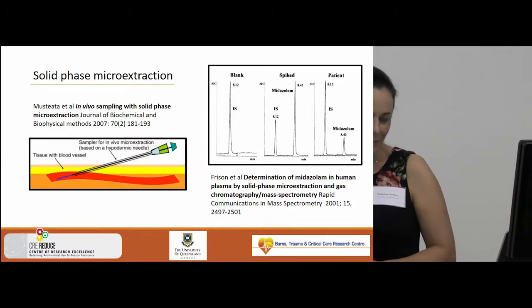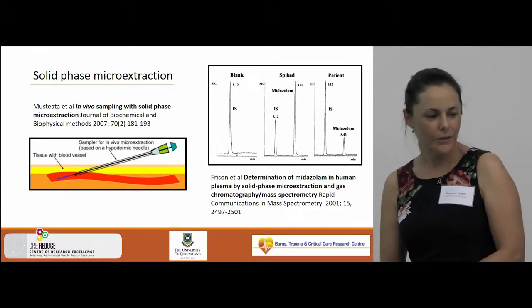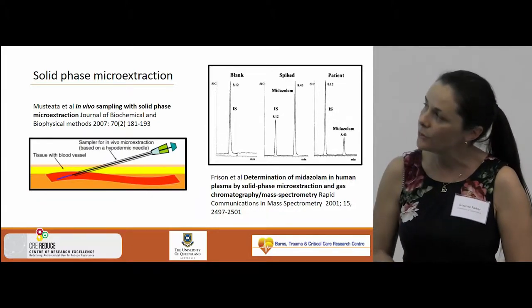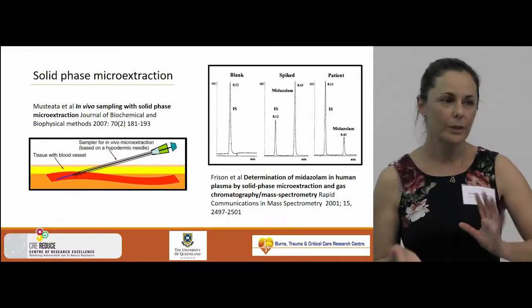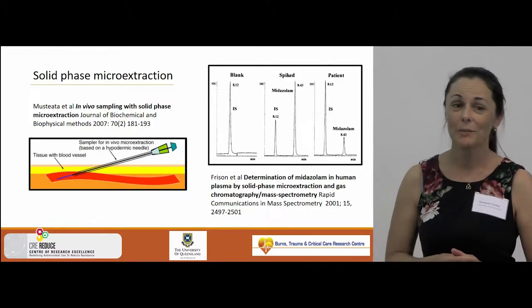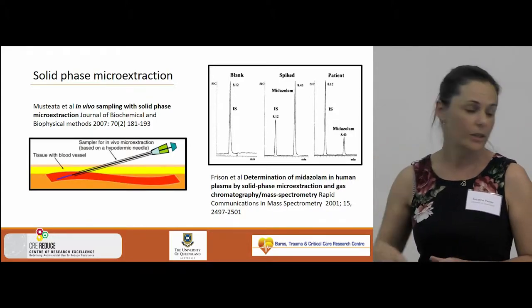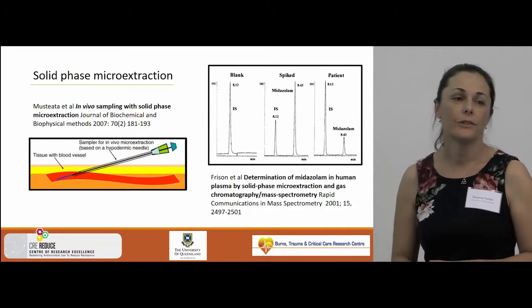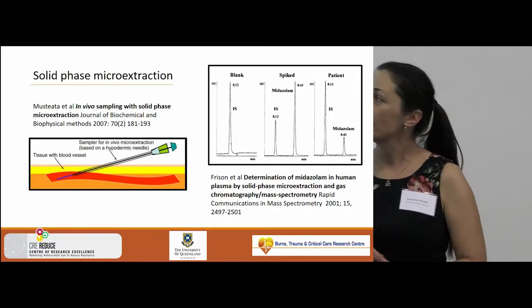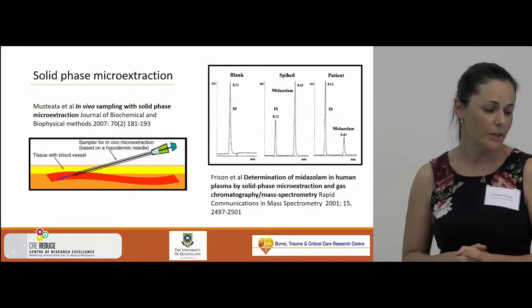This is something we've looked at many times, solid phase micro extraction. The idea is that you take a pre-coated biocompatible fibre and you insert it through the tissue into the blood vessel, and it equilibrates with your blood sample, and when you remove the fibre, you're collecting free levels. And you've probably heard from me a bit, but we're really after unbound concentrations. So this is a way of achieving that. One of the advantages is there's no blood draw. All you're removing is a small amount of drug. So it's got potential as an idea of measuring unbound levels.